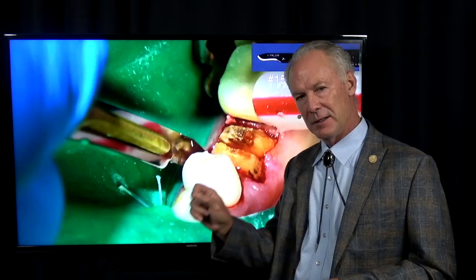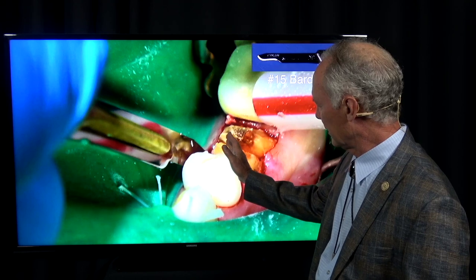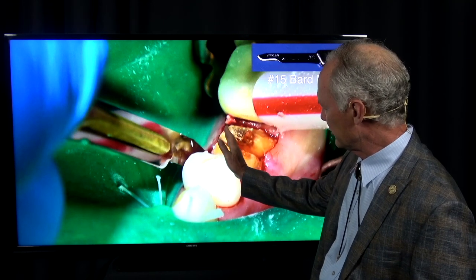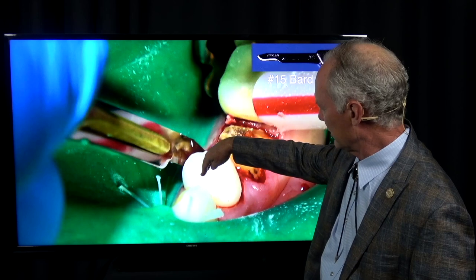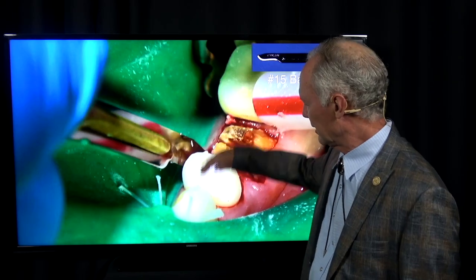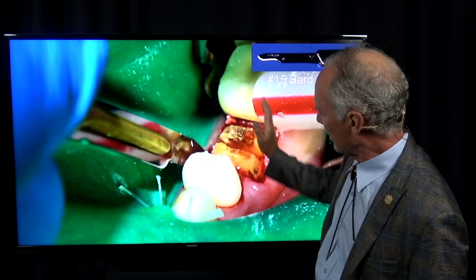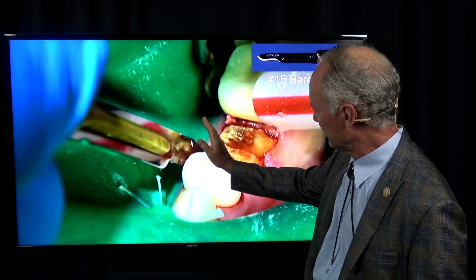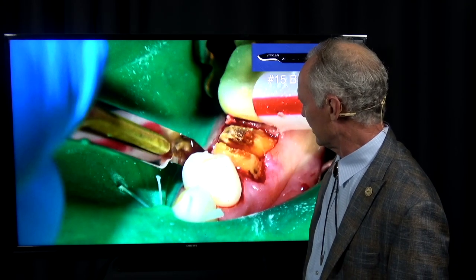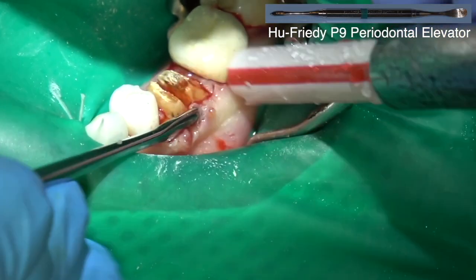Remember, if you're using a high-speed handpiece to section the tooth, never elevate the flap — especially on the lingual — past the attached gingiva. You want to leave a significant portion of attached gingiva in place so you don't get an air embolism. I've never gotten one in 40 years, but if you elevate all the attached keratinized gingiva down to the unattached non-keratinized tissue, that's when you get an air embolism using a high-speed handpiece. Don't do that.